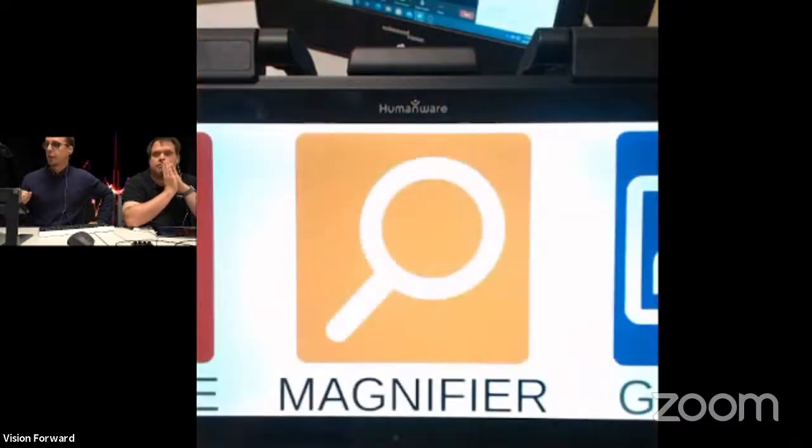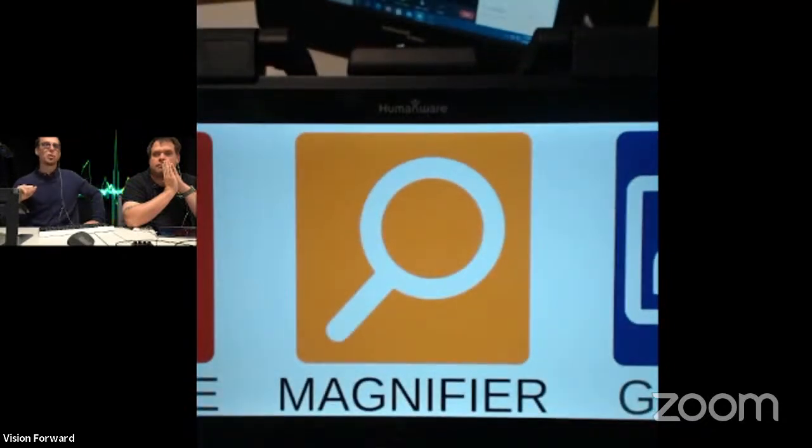Jason tells us you can get the Sony camera as an option with the Connect 12. Oh, interesting. Look at all these intelligent people we've got with us today. I don't know why we shouldn't just unmute them. Yeah, and we'll just let them do the show. Yeah, exactly. That would be great.